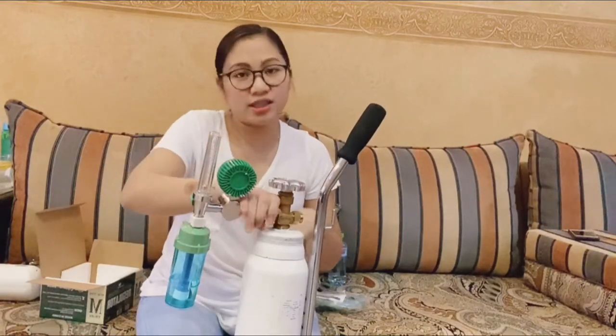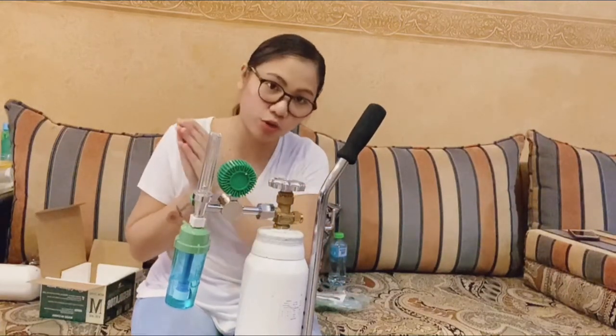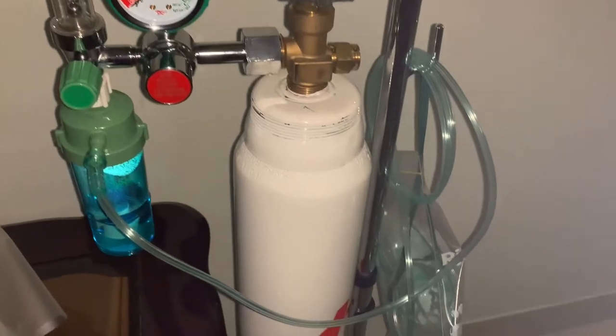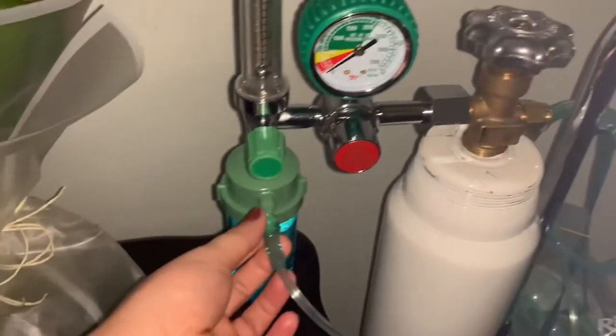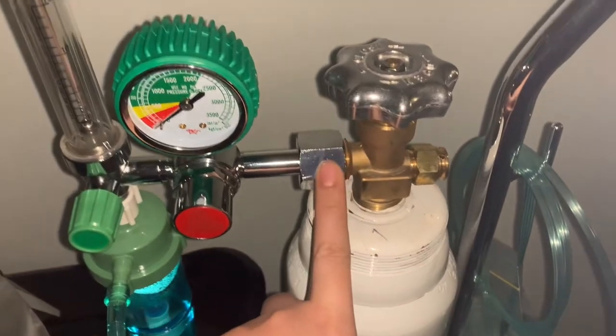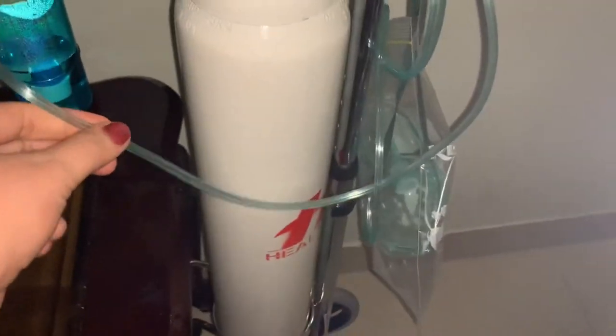This oxygen, guys, is just for emergency only. It's not necessary that we use the oxygen. But Umi is on home quarantine — she was discharged from the hospital. So that's our oxygen, guys. The tube is prepared — ready to use. This lock here — I wasn't able to lock it myself, but I had our driver lock it. So it's all installed now — ready to use.